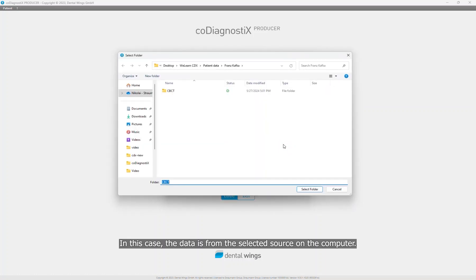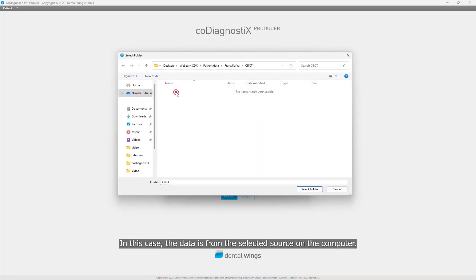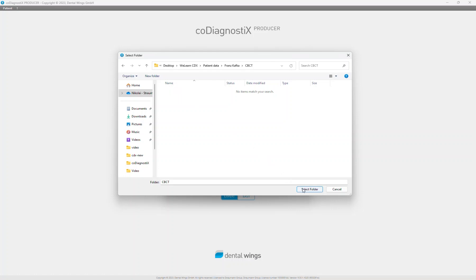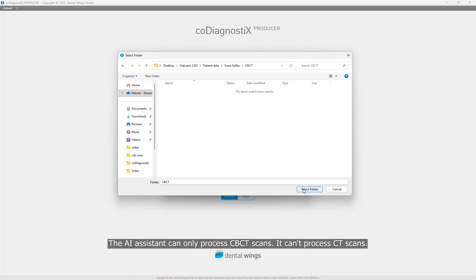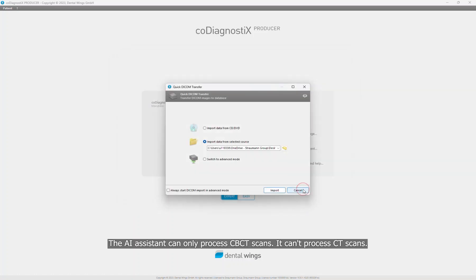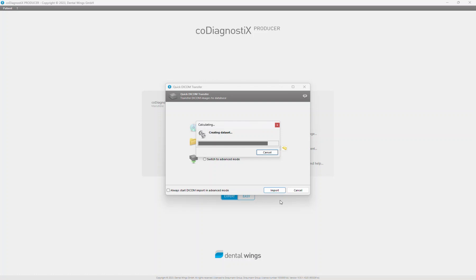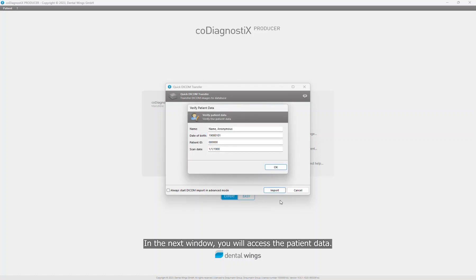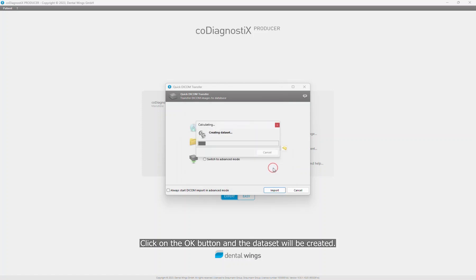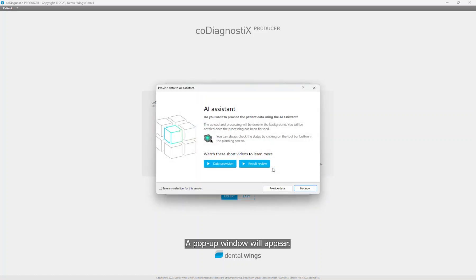In this case, the data is from a selected source on the computer. The AI assistant can only process CBCT scans, it can't process CT scans. In the next window, you will access the patient data. You can rename it or leave it unchanged.